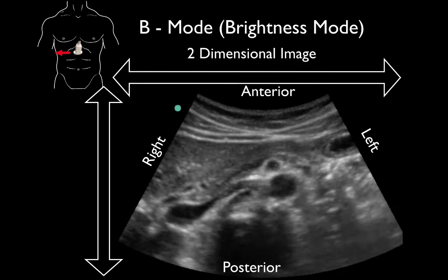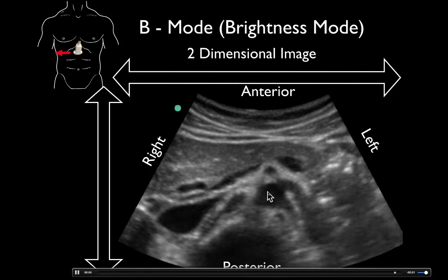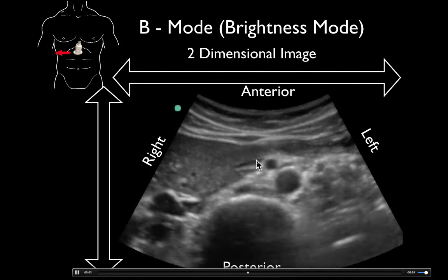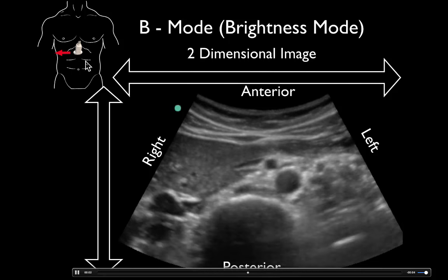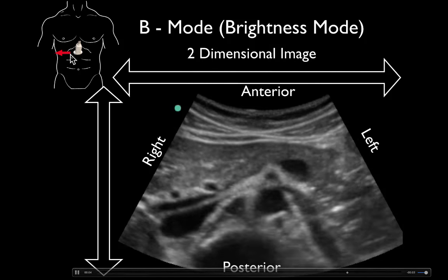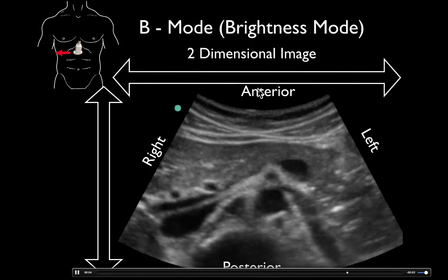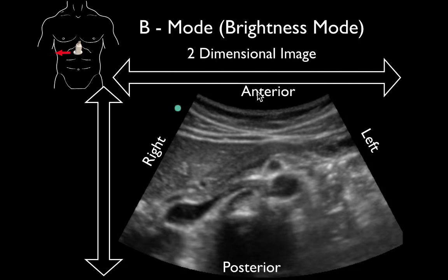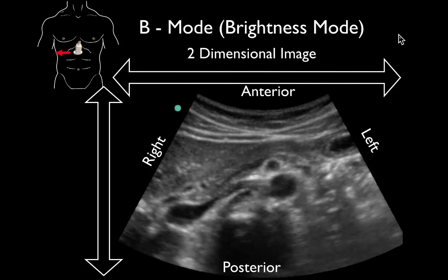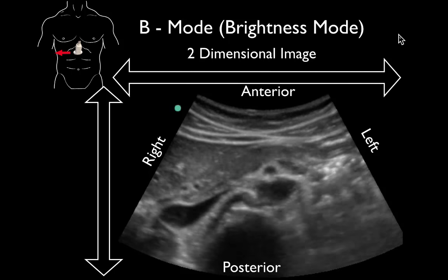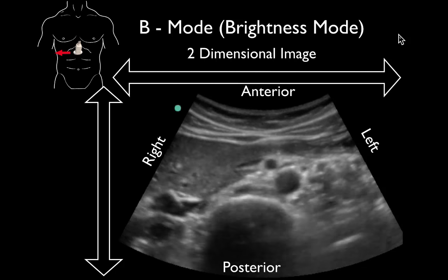Let's go ahead and see that in live video. We can see those structures again: the vertebrae deep, our aorta, the SMA coming off of that, the splenic vein coming across to the portal system, the IVC, and the big liver over here. Once again, our probe marker is toward the patient's right — that's our x-axis coming across — and the patient's left is directly opposite. Anterior is where the probe is placed, and where we're aiming is posterior. So we get our 2D image, which is a grayscale of different brightnesses of gray, and that helps us appreciate what we're seeing.